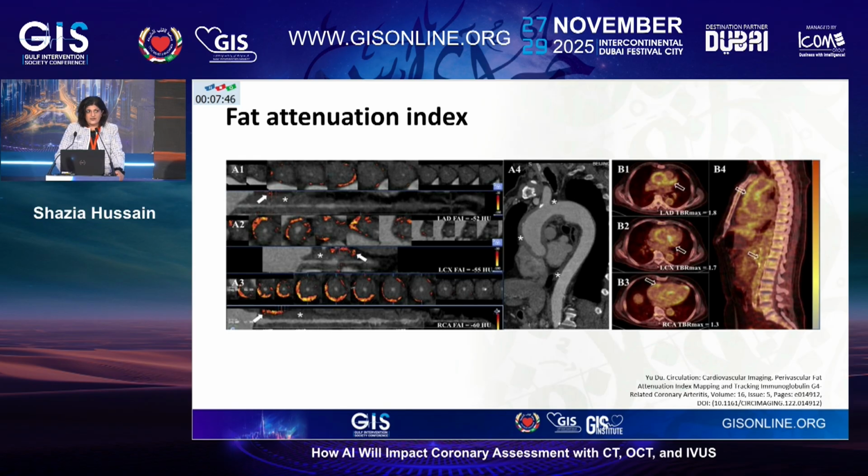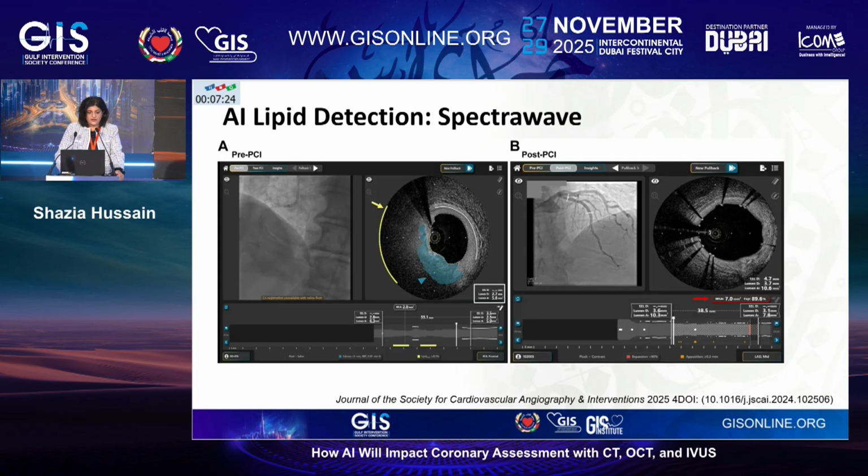Nope. Yeah, so a few people. So we can send these off, the CT scans, and get an indication of perivascular inflammation. And the suggestion is that these patients would do better from intensive lipid lowering. So if we could do that for our patients, then we can manage them better in the long run.